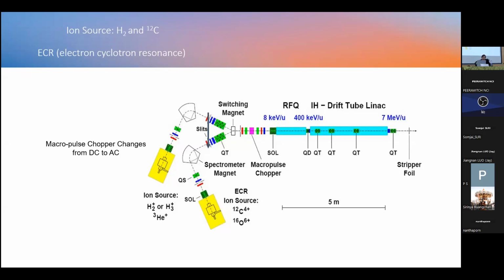The demonstration here is actually for an ion therapy. You can see there's a source for carbon, oxygen, and there's also a source for alpha particles, helium, and proton. But they all have the same thing. You have to first get that source. You've got to strip the electrons off of, let's say, the hydrogen atom, and that's just floating. Now you've got to accelerate all of these together and focus them a bit. That's what all these are for, so you can get the energy you want and get them focused. And then in order to inject into a synchrotron, you can't just inject them at zero energy. They need some momentum in order to be injected and start their acceleration around this ring.